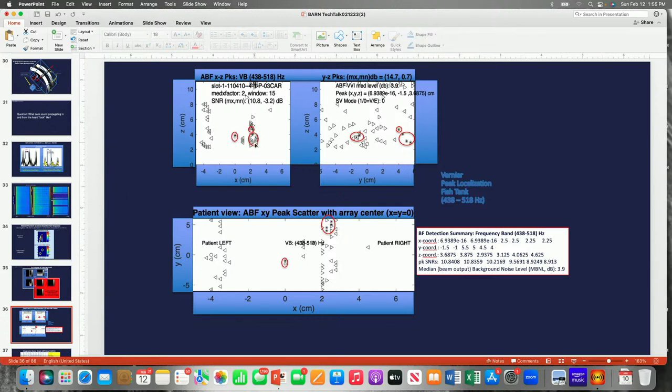And we circle them. This happens to be right over the left anterior descending coronary, and this is the left circumflex making noise. So the indication here is that right under intercostal space 4, there's a blockage, the branch point is close by, and there's something going on in the left circumflex. And sure enough, this guy, 4 weeks later, had 4 stents put in, 2 in the left circumflex and 2 in the LAD. He had already been through diagnosis, so he knew he was going in for stents in a couple of weeks. So verification, I don't know. We think it's a validation of our theory.